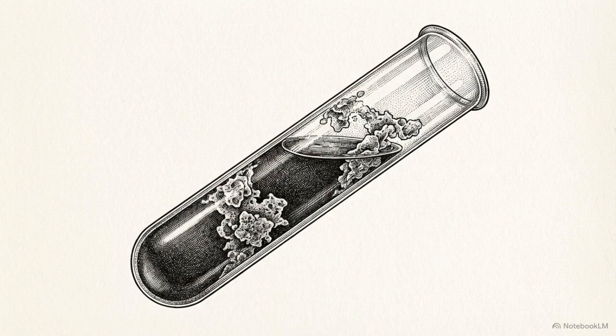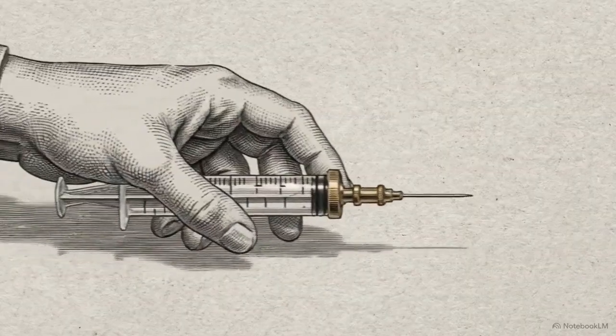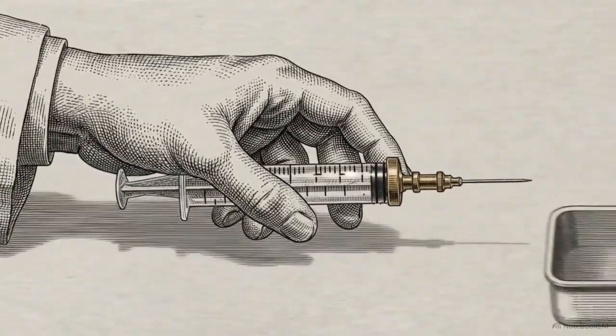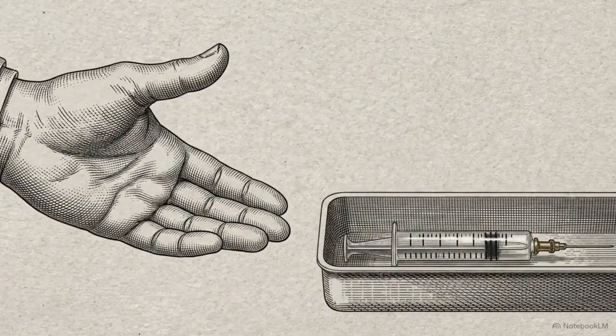It is a false low reading, caused entirely by mechanical clumping in the test tube, not an actual platelet deficiency. Reviewing a peripheral smear intercepts the error and prevents a healthy patient from receiving unnecessary treatments for a fabricated bleeding disorder.